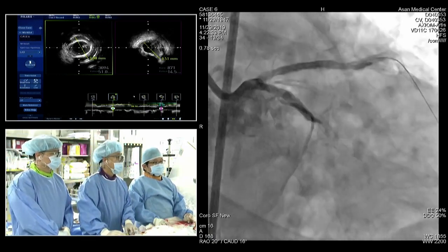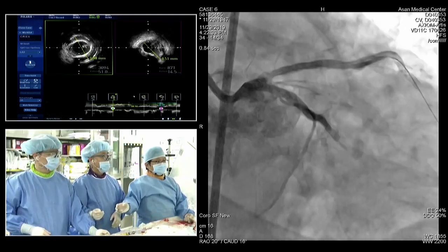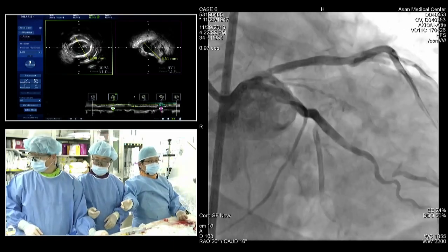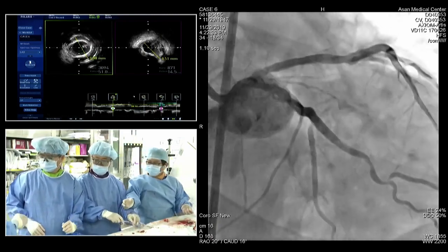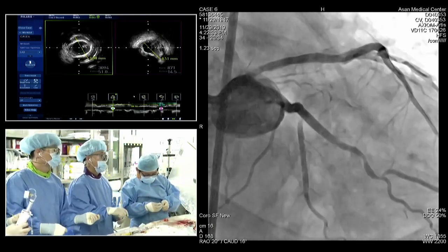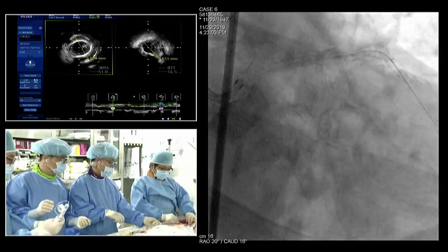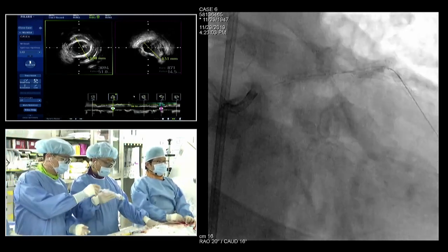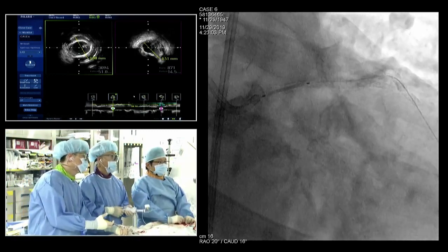Proximal part, very proximal. Would you want to do just a precise placement or just stent crossover over that? Precise stenting. I'll try precise stenting, but maybe crossover. Maybe I will cross over circumflex too. This is a 3.5. Okay. 35.